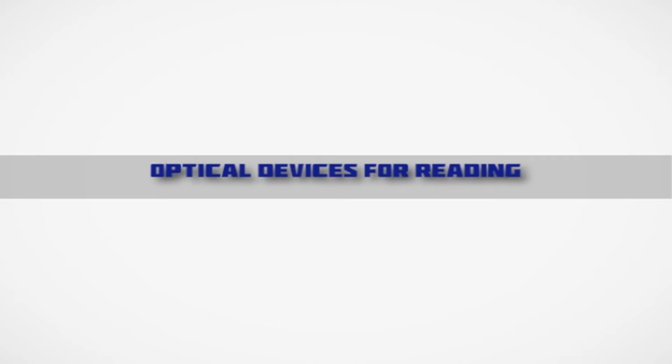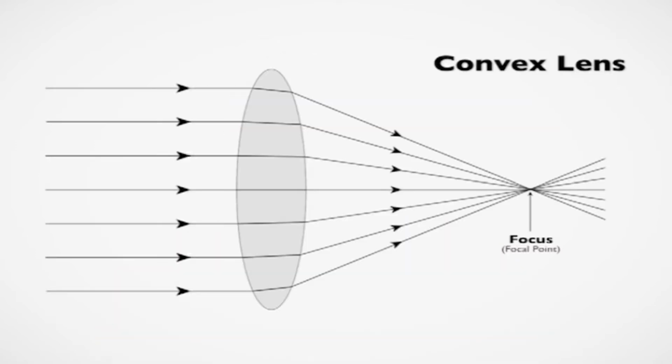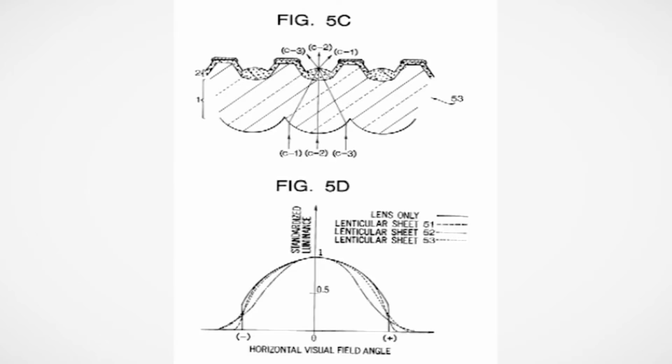Optical devices for reading: spectacle magnifiers. Low vision spectacles are monocular or binocular convex reading lenses mounted in standard full diameter or half eye frames. In other words, they are really simple magnifying lenses fitted into a spectacle frame. The convex lens functions to enlarge the images projected on the retina. The lenticular design lenses have less peripheral aberrations.